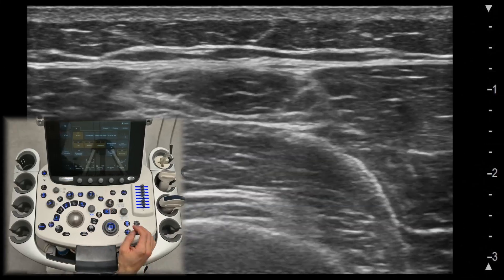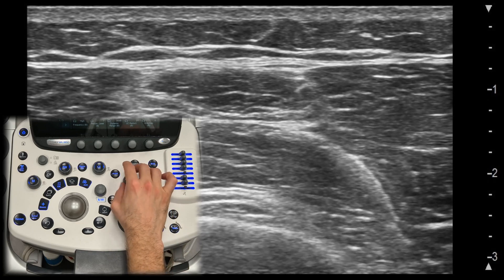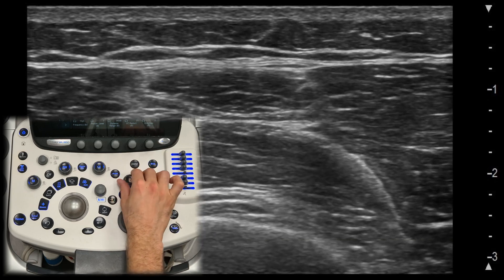Gain control. Gain controls the brightness of your image. Too much gain will make your image look washed out, while too little gain will make it too dark. The goal is to adjust it just right so you can distinguish tissues without losing important details.